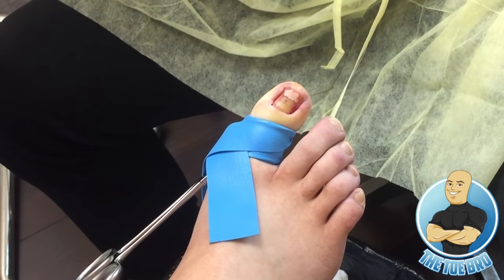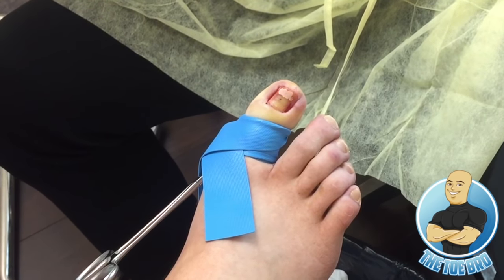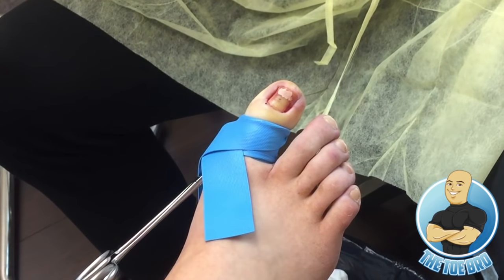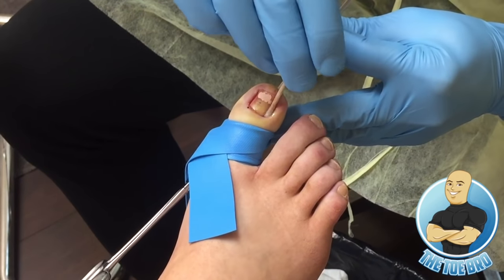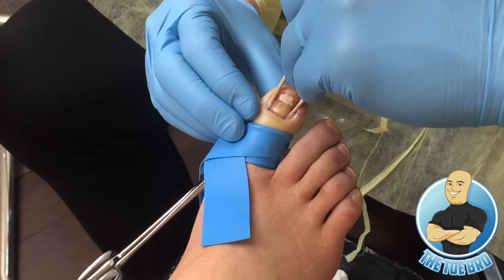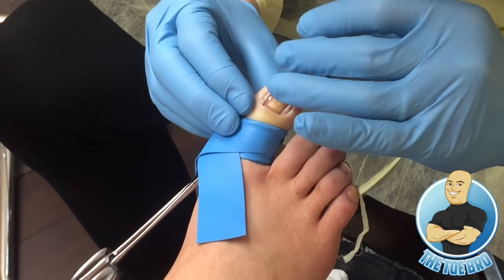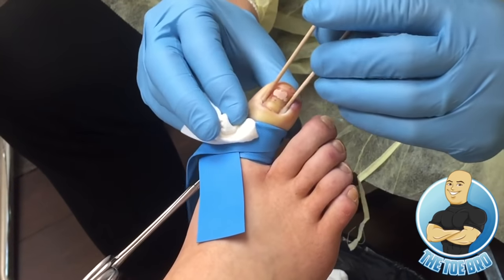So once I know that there's no ingrown portion left behind, that the nail has been cut properly, there's no debris left behind, and the area is very bloodless, then I will apply the acid. So what we're using today is an acid called phenol, and it's a very, very strong acid. What it does is it chemically cauterizes or kills any sort of soft tissue cells.